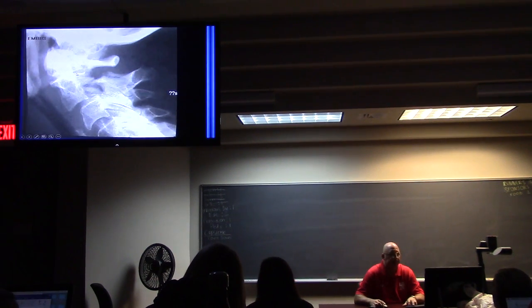Recognize that now? See the anterior vertebral line and the posterior vertebral line are messed up? Everybody got that, right?